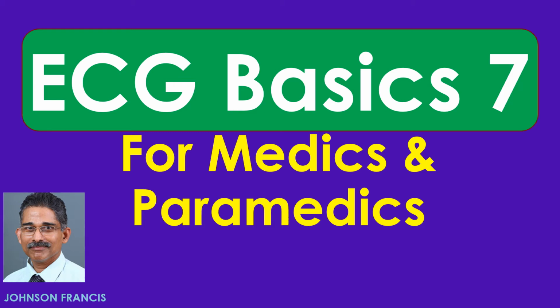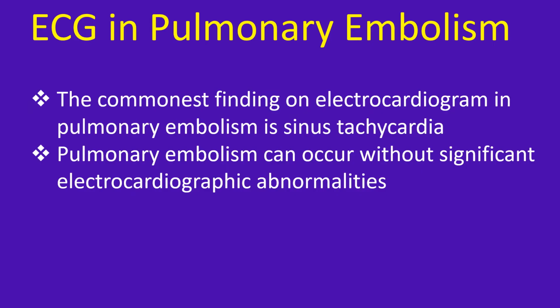Seventh lecture in the series on ECG Basics. We will start with ECG in pulmonary embolism.